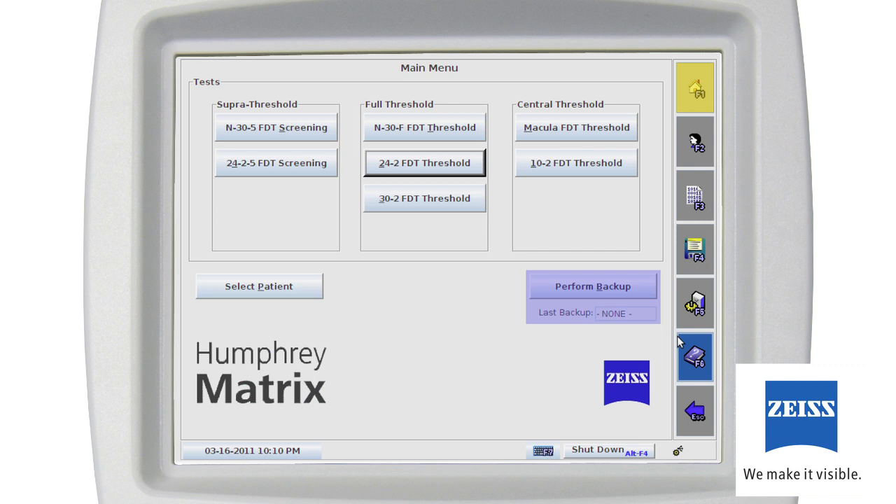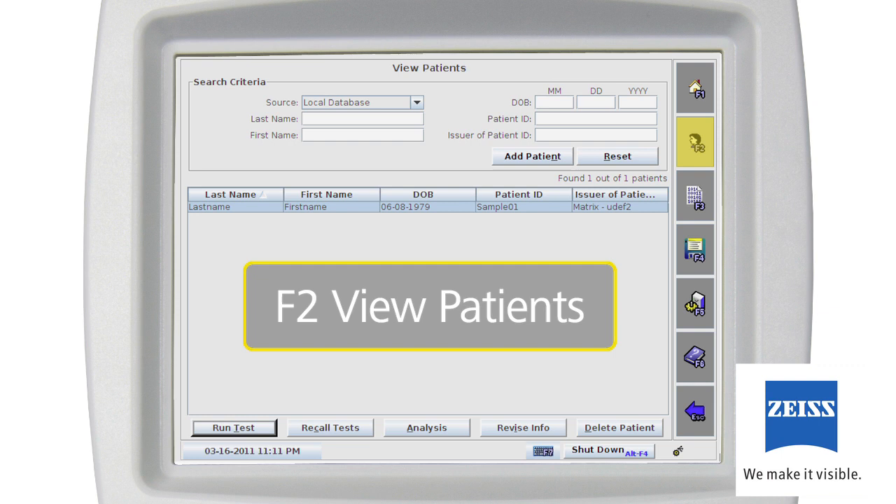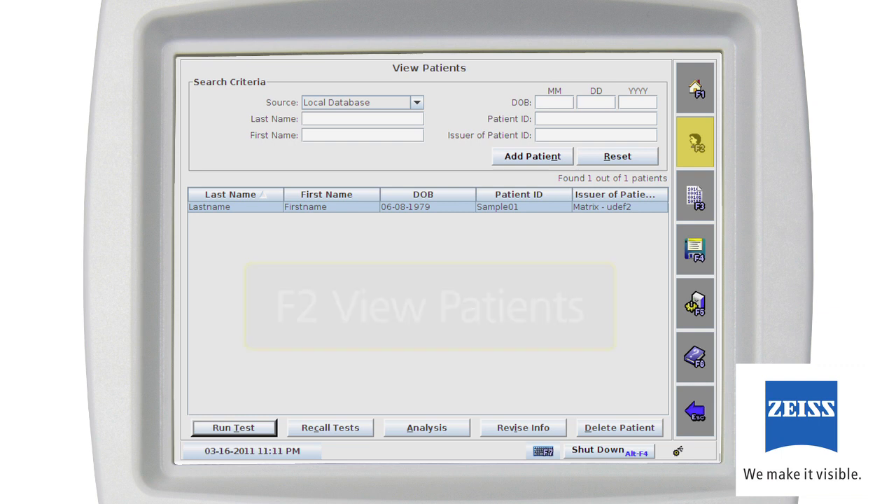You should back up your database regularly — pick a backup schedule that fits your practice. This screen also contains a system shutdown button. Always use the shutdown button before turning off the instrument power. The main toolbar is located vertically along the right side of the display and is always visible. Use the toolbar to navigate the available functionality of the instrument. The View Patient screen, F2, is where new patients are added or existing patient entries in the database are searched, recalled, and revised.